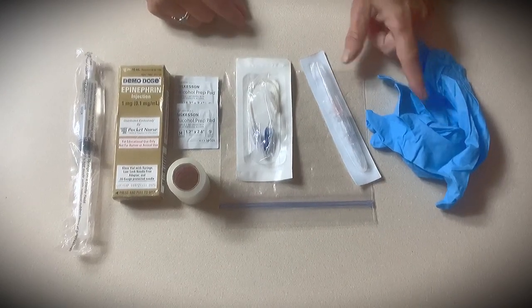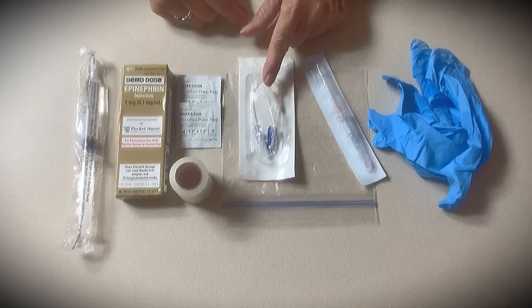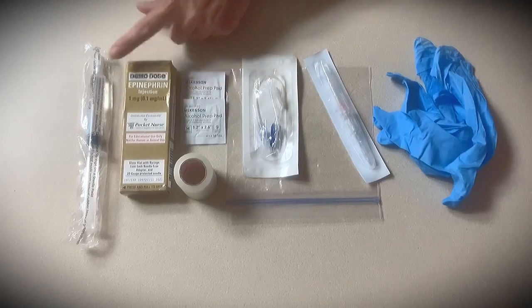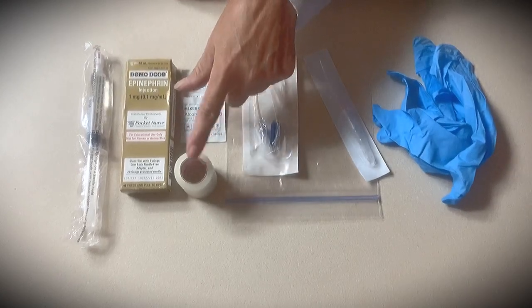You're going to need a set of non-sterile gloves, angiocath, extension set from your med-surg nurse pack, ziplock bag, couple of alcohol pads, epinephrine, saline flush from your complex needs nurse pack, and tape of any kind.